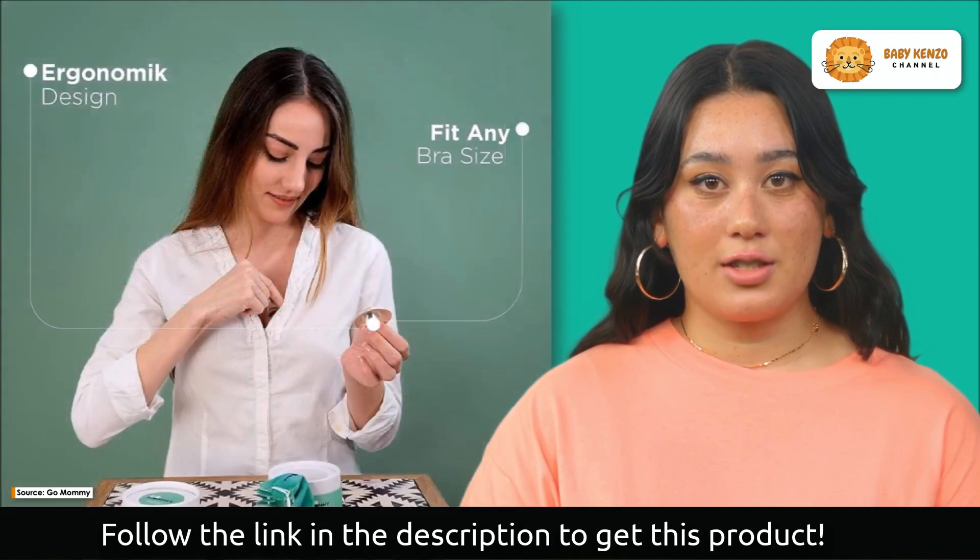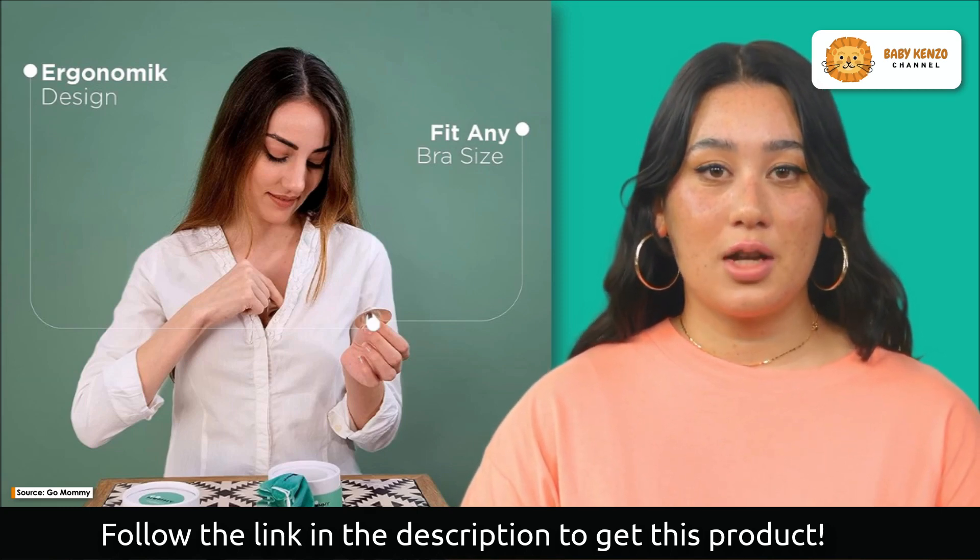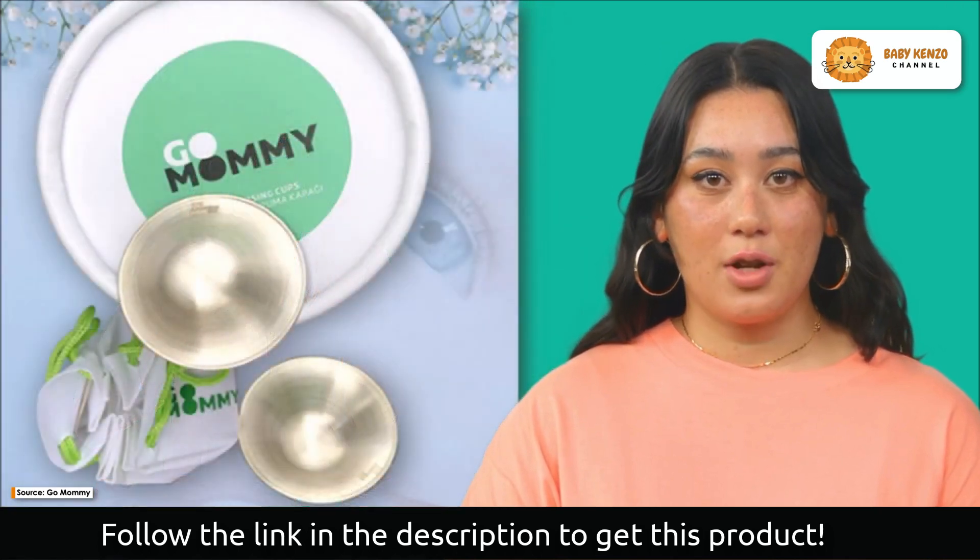Handmade to perfection, they offer a speedy recovery for sore or cracked nipples without the need for additional nipple lotions. Silver possesses magical properties, ensuring remarkable effectiveness and optimal hygiene.